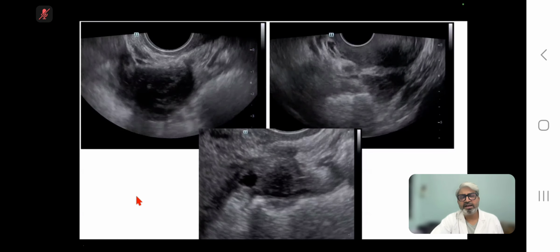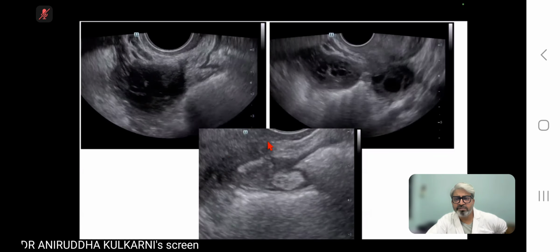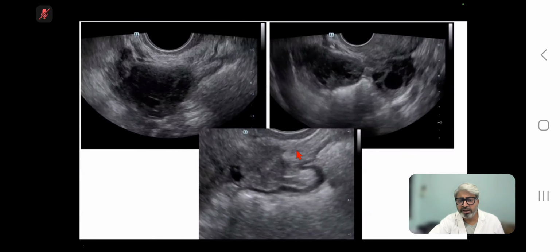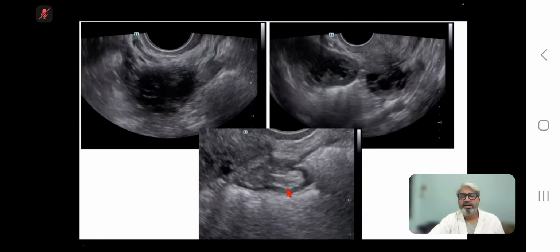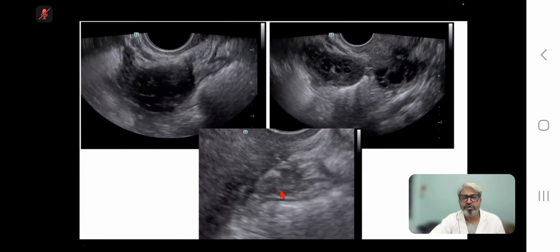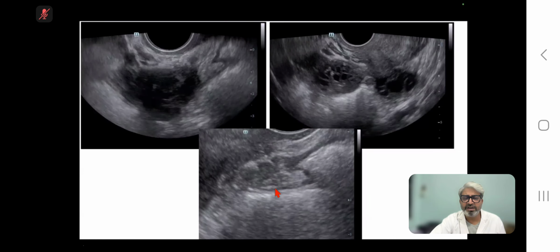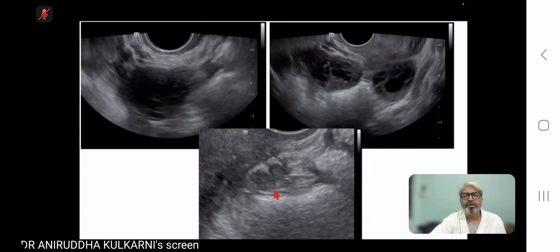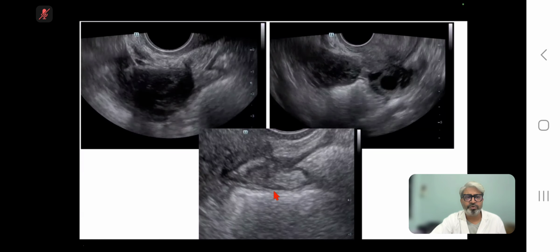Whenever you are looking at adenomyosis, it is my duty to look for other features of endometriosis, in the form of ovarian endometrioma or a saucer-shaped lesion involving the bowel, to be stated as deep infiltrating endometriosis involving the bowel. That can be seen and demonstrated by the retrocervical sign of fixity, by the upstream sliding sign, and also by looking at the torus and uterosacral ligament, which we'll see in due course of time.